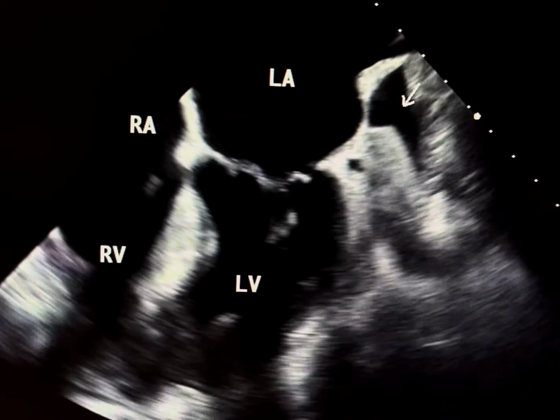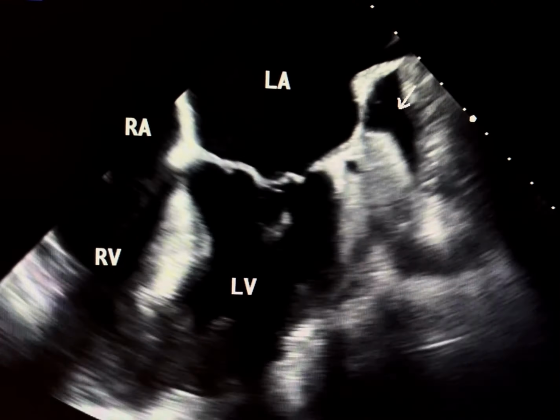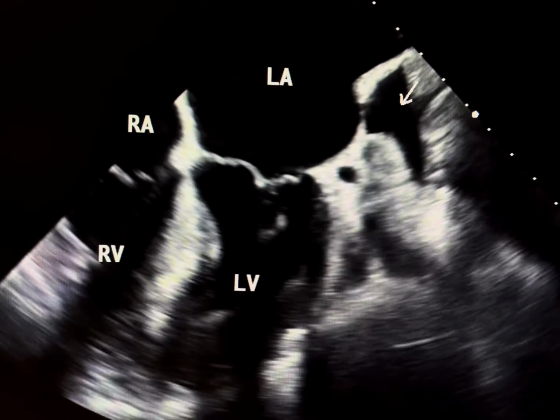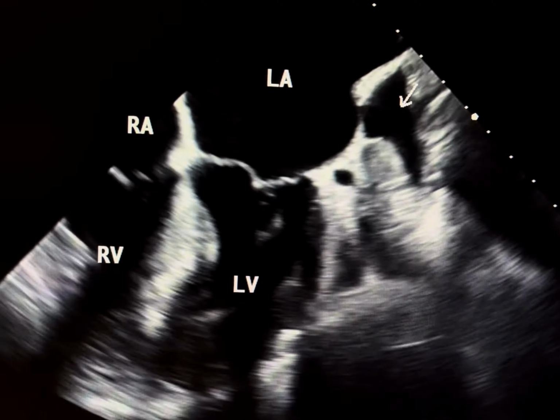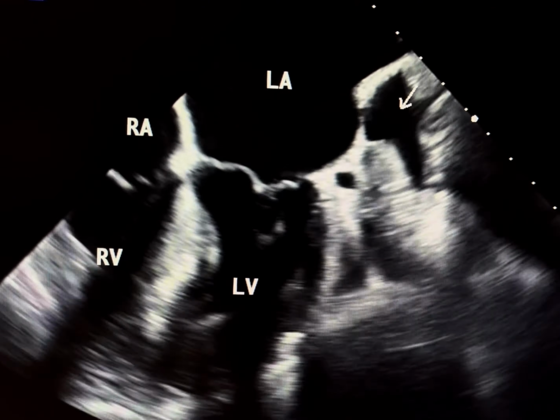So when examining these cases, it's important to keep in mind that pericardial effusion with fibrin clumps can closely mimic true LA appendage clot, and careful assessment of the mass location and its relationship to atrial structure is crucial to avoid mistakes. I hope this video has been both informative and fascinating.